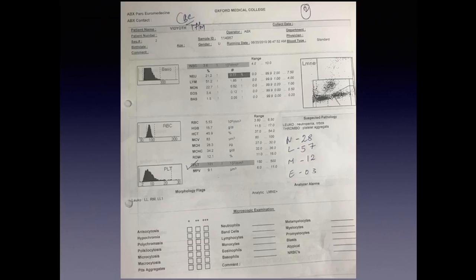So upper part will contain the patient's details, and then in the lower part you can see certain numericals, and also you have the scatter diagram and histograms. So it gives information like total WBC count, and then the differentials followed by the total RBC count, hemoglobin percentage, hematocrit, then the RBC indices like MCV, MCH, MCHC, red cell distribution width, platelets, and the mean platelet volume. So when you get a printout from the automated analyzers, when it is normal, there will not be any flagging of the results.